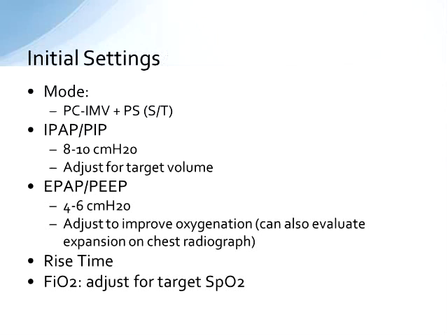So going forth in that vein, some initial settings you might see. For a patient that you're using it on prior to intubation, or in an effort to avoid intubation for kiddos in acute respiratory failure, you might consider using, again, PC-IMV plus pressure support with an inspiratory positive airway pressure of around 8 to 10 centimeters of water pressure above PEEP in many cases, then adjusting it for your target tidal volume.